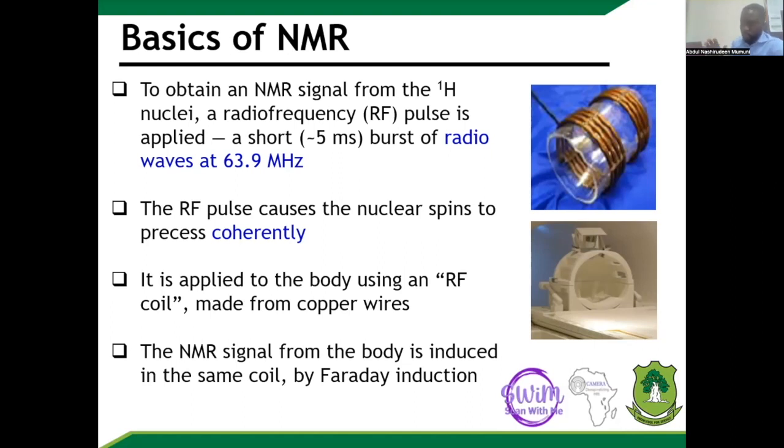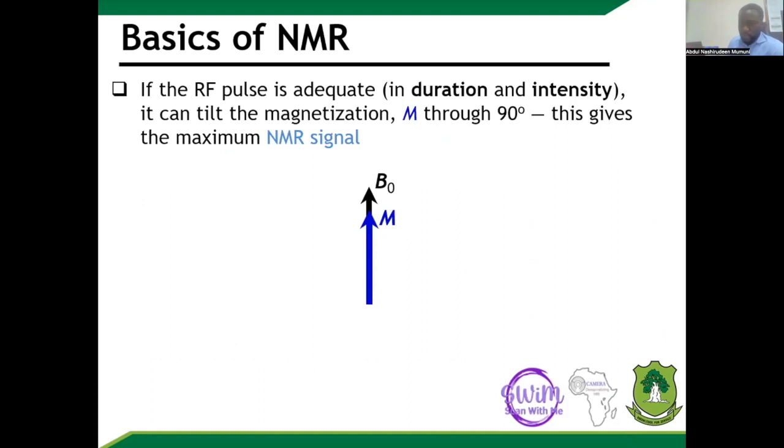When we send in the radio frequency pulse, it has the characteristic of pushing down the spins toward an angle equivalent to the angle it is created to do the perturbation at. For example, the commonest excitation pulse we use is the 90-degree radio frequency pulse. And this is what it does. When we apply it to the human body, the spins that are aligned parallel to the static field are pushed down to 90 degrees relative to the original position.